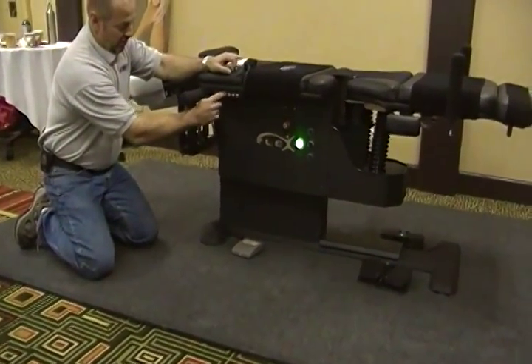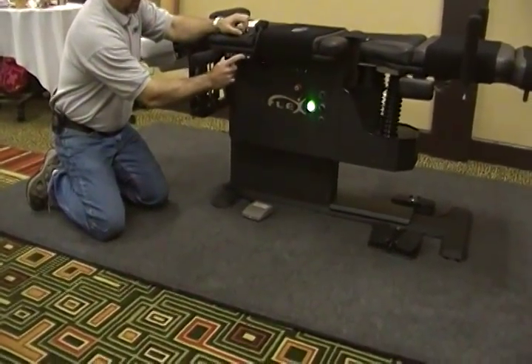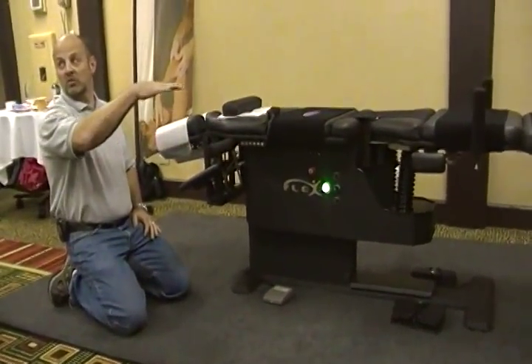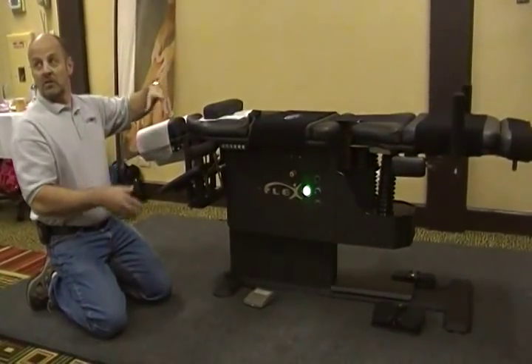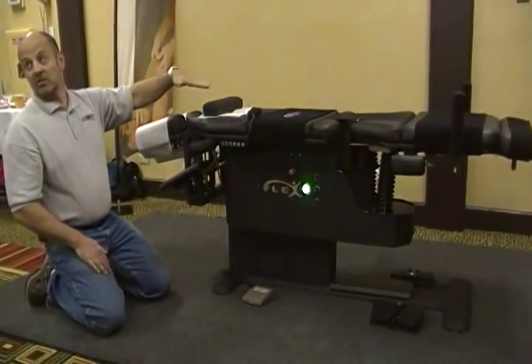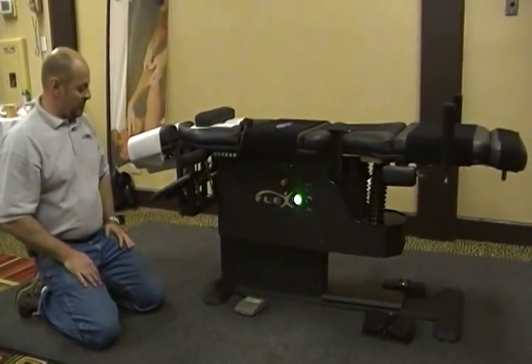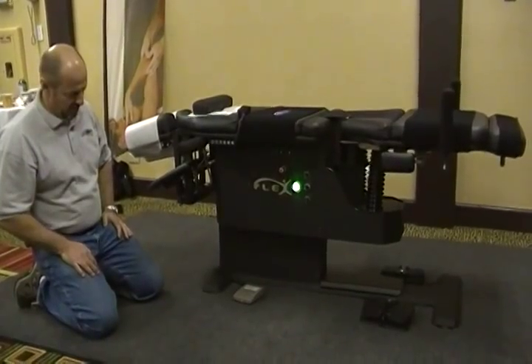User 1, set 1, user 1, set 2, user 2, set 1, user 2, set 2. So somewhere in between, you like to do your cervicals, supine, set the table to that height, and someone of normal height, like Mike, comes along, he does supine cervicals a little higher. You know what I mean? So that's about all I can think of, Peter.